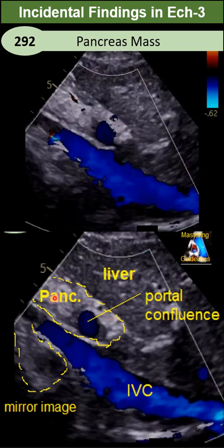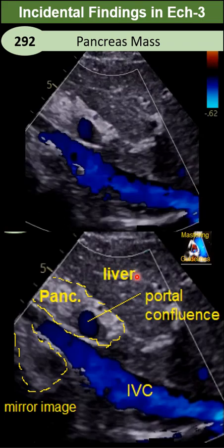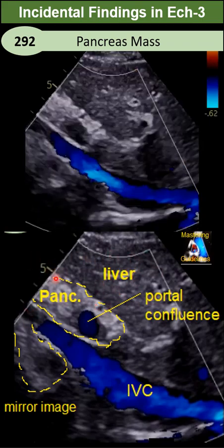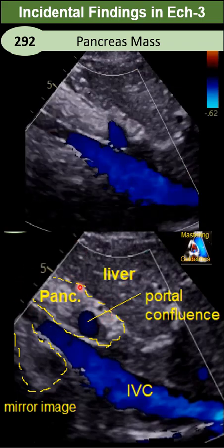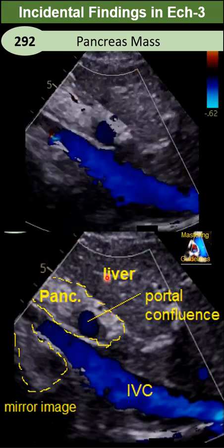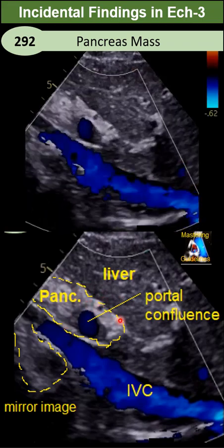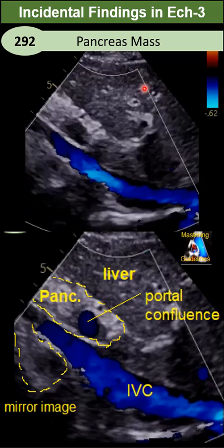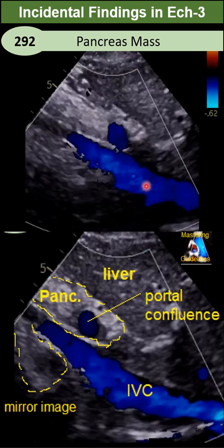With increasing age, it becomes little by little more echogenic. In middle age, it becomes almost close to the echogenicity of the liver. And when they go older, or with fatty infiltration or alcoholic or other situations, and old age, it becomes hyperechoic. As you can see, this is hyperechoic compared to this one. This patient is 65 years old.